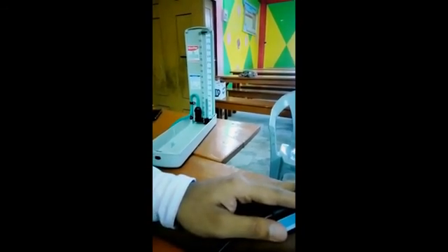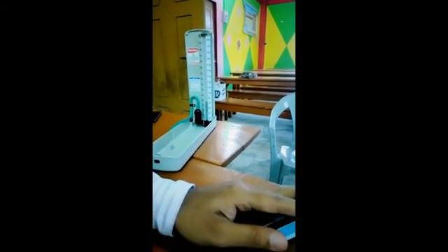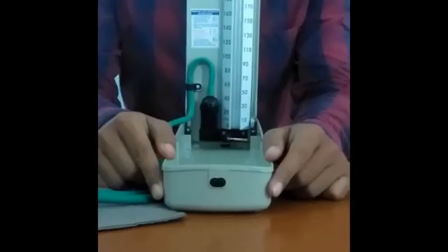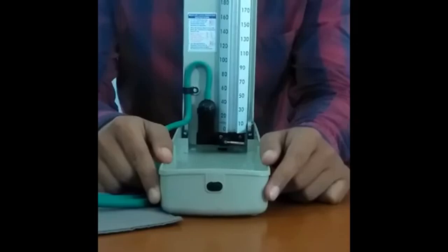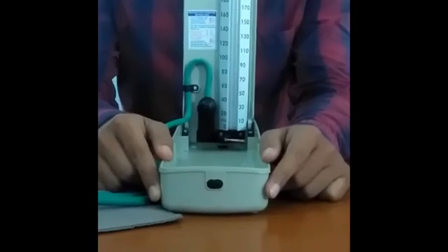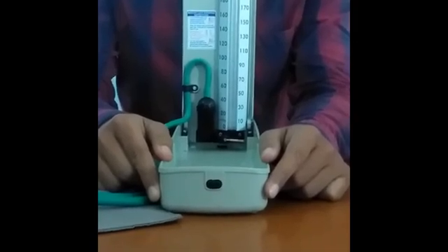For the subject today, we got 120 mmHg systolic blood pressure and 80 mmHg diastolic pressure, which is very normal. We conclude that today's practical has been successfully completed. Thank you.